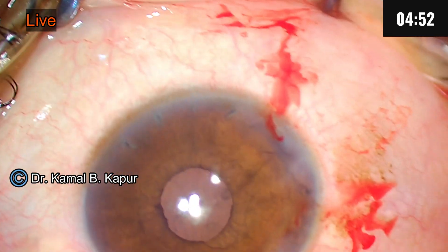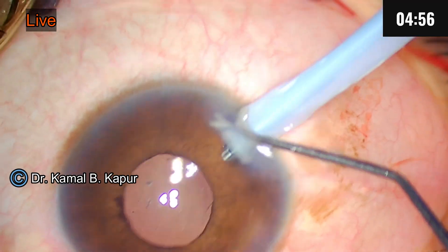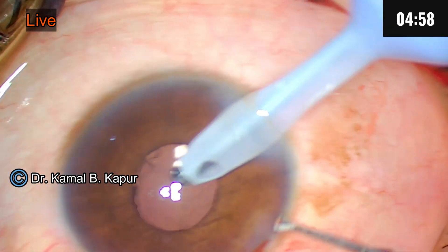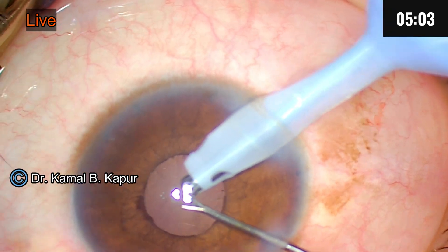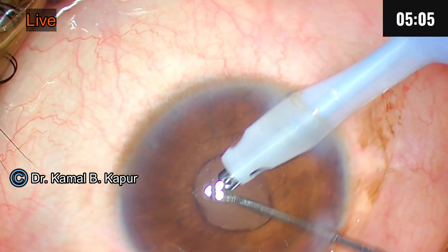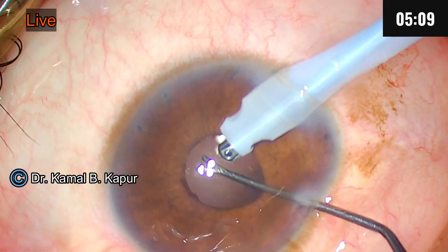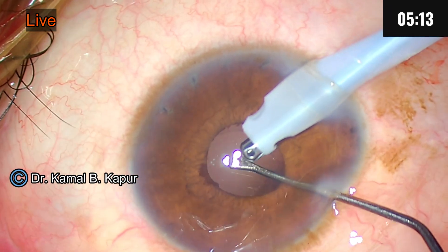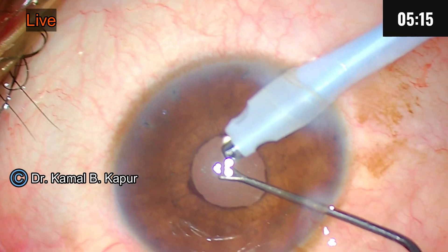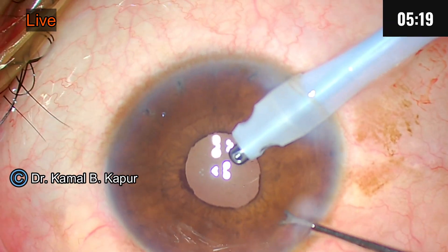If we had proceeded with cataract surgery without performing these iridotomies, we would have definitely landed in trouble because there would have been an acute angle closure. The lesson learned from this video is: whenever you have a shallow anterior chamber with a cataract — especially an intumescent cataract — act carefully. This patient had an anterior chamber depth of 1.28mm on biometry. This was a disaster waiting to happen.